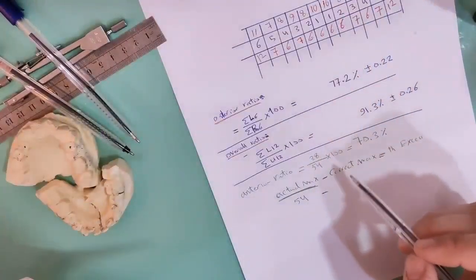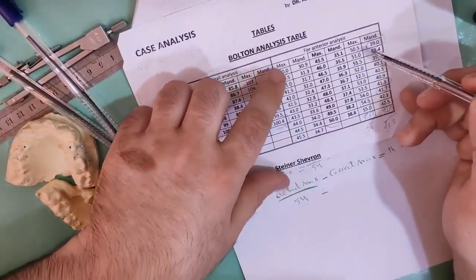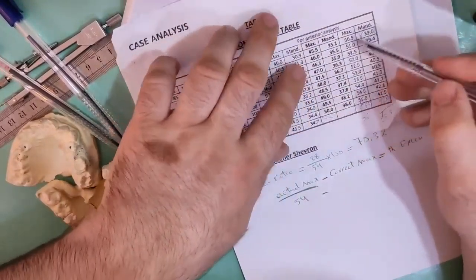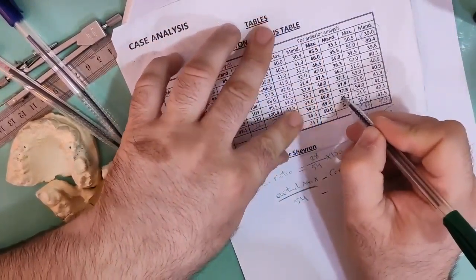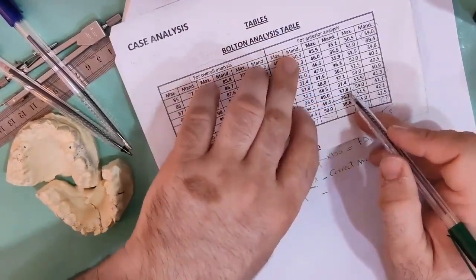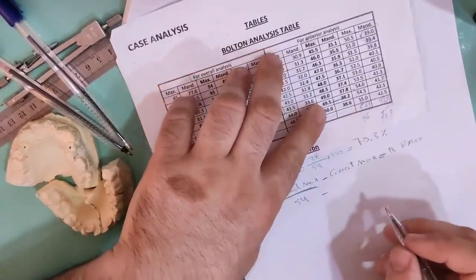So we are looking for the right maxilla number according to this table. We have here lower 6, 38, and we look for a mandible of 38. Here we have 38.2, and here 37.8. We can choose 38.2. The maxilla is 49.5.